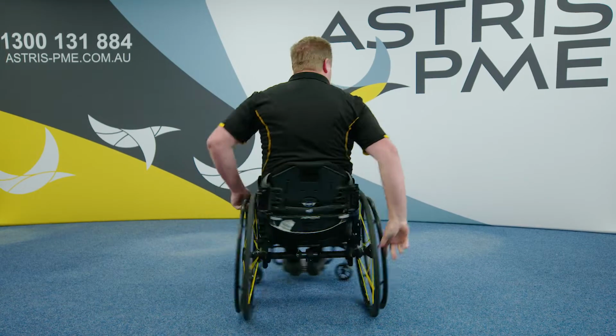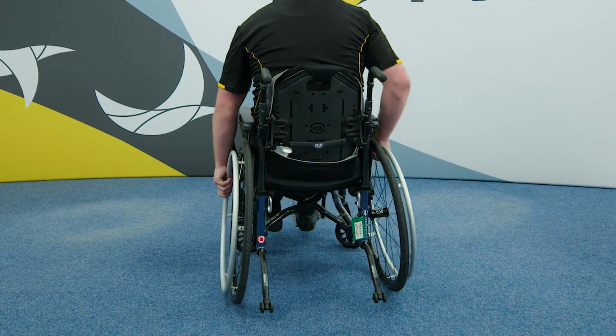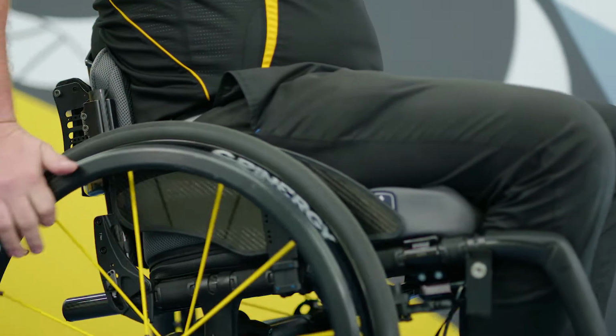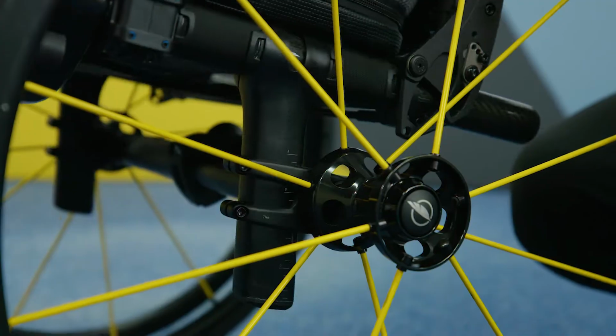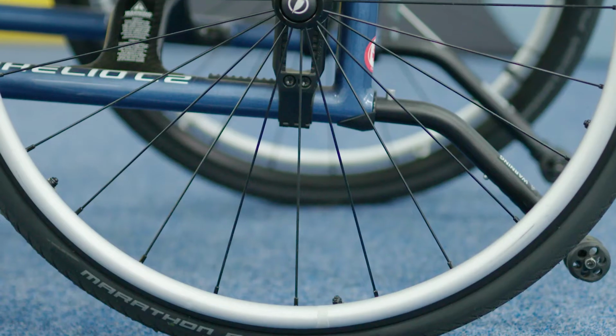When selecting a wheelchair, it's important to consider the frame build. Typically, frames are built of aluminium, carbon fiber, or titanium. The weight of the wheelchair is influenced by the material build. The lighter the wheelchair, the less energy used to propel the wheelchair. When selecting the frame material, it's important to consider strength to weight ratio. What does this mean?